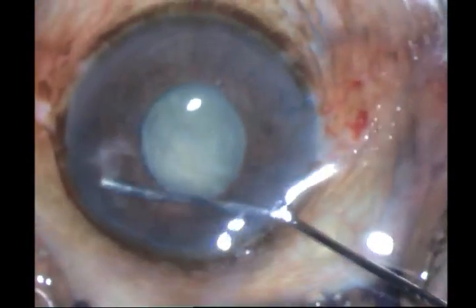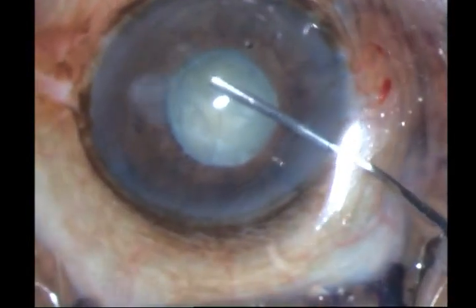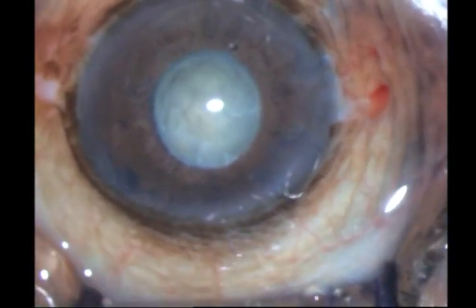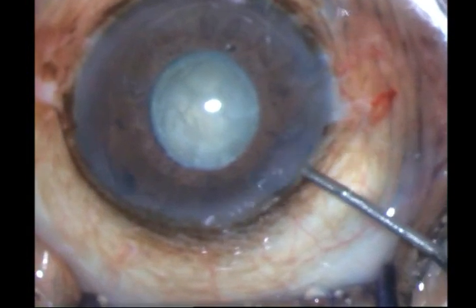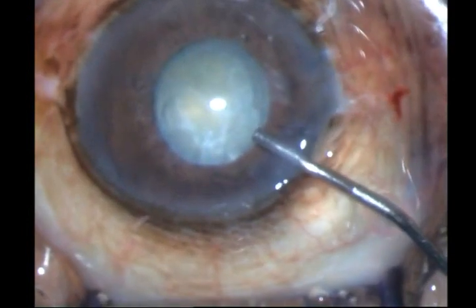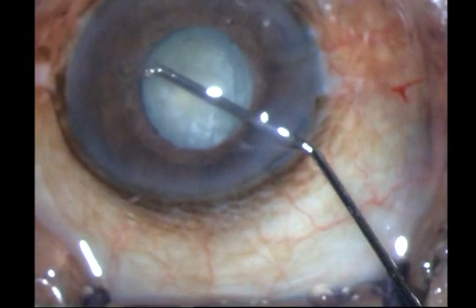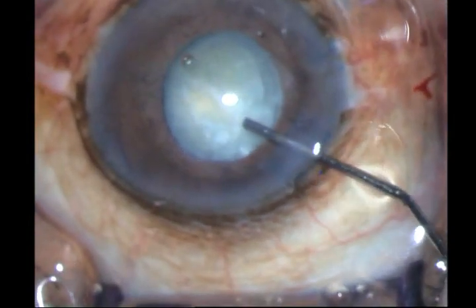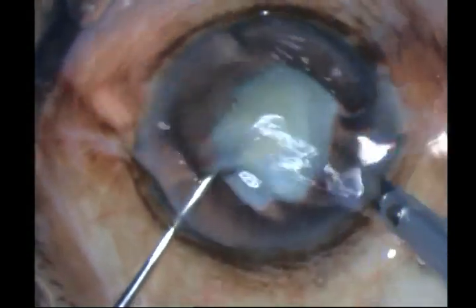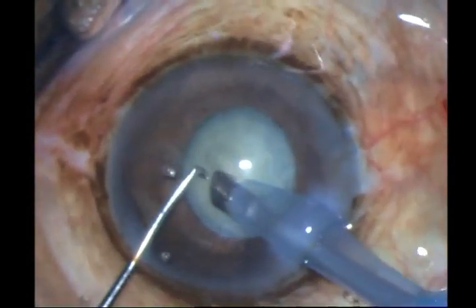I do not plan to use any expansion device and hence I have to be very careful. Then once again I place HPMC within the chamber, take out a bit of the HPMC and put in some sodium hyaluronate, and then proceed with my 2.8 millimeter phaco.